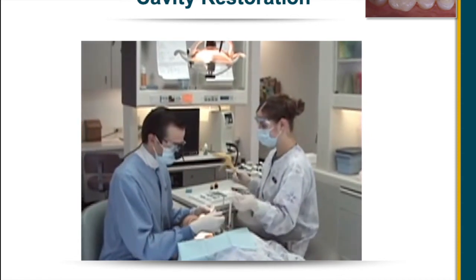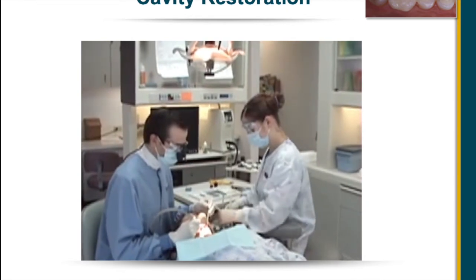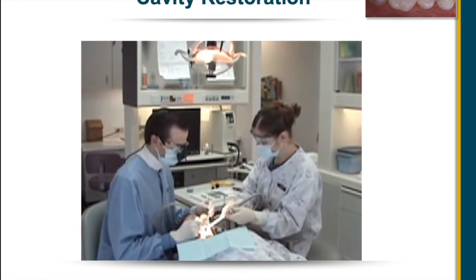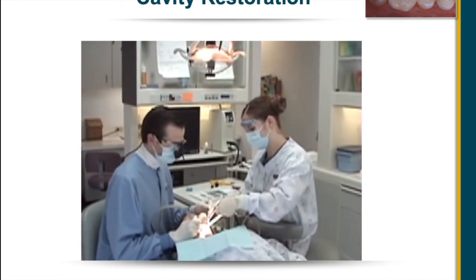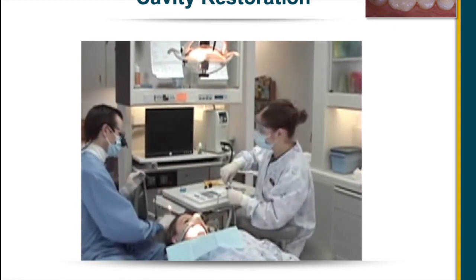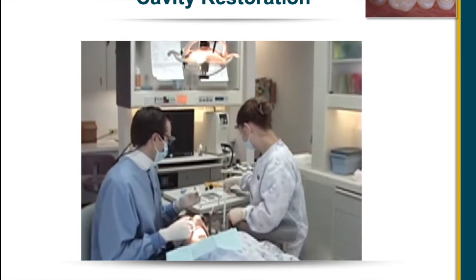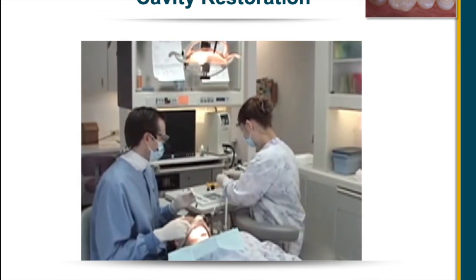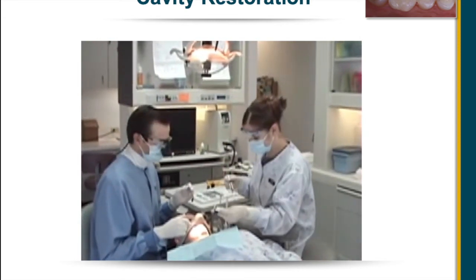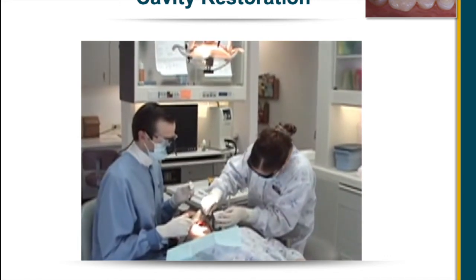It's important to consider ergonomics as a dental assistant. Your back and your neck can become extremely sore if you're not positioned properly and not using your equipment properly. However, if you are using your equipment properly, you can enjoy a long, rewarding career. So note the straightness of the assistant's back and neck, that she's able to reach all of her instruments comfortably without stretching or going into unusual and contorted positions, that she's able to reach everything comfortably and move quickly and efficiently to complete the restorations.